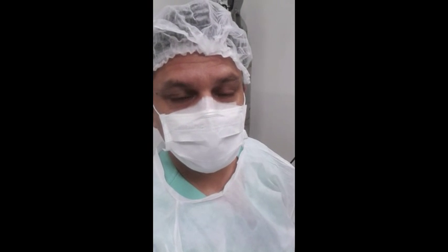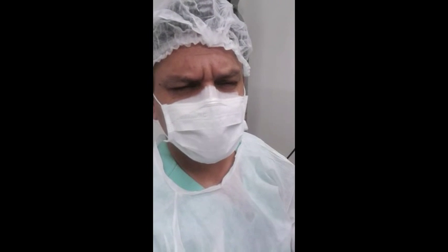This patient has a closed funnel retinal detachment, a very hard case with PVR, proliferative vitreoretinopathy.